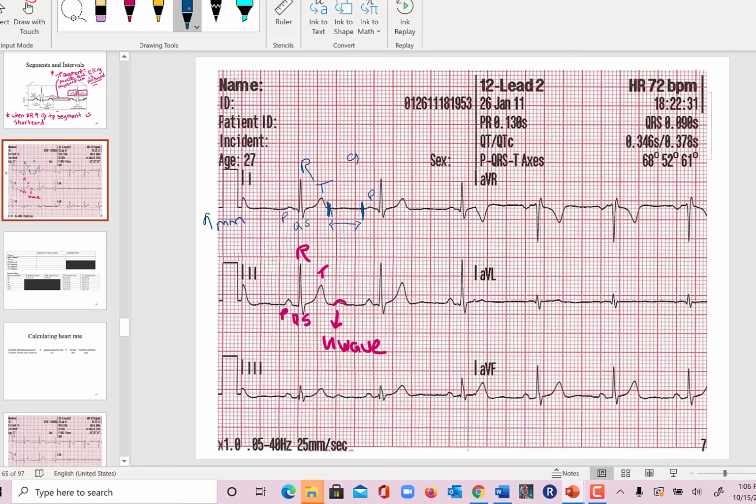Okay, so if I have 9 millimeters, my paper speed shown down here is 25. So according to the equation I showed you, 25 millimeters per second equals 9 millimeters, and solve for time. So that means time equals 9 divided by 25.